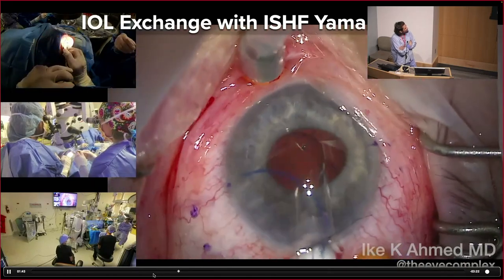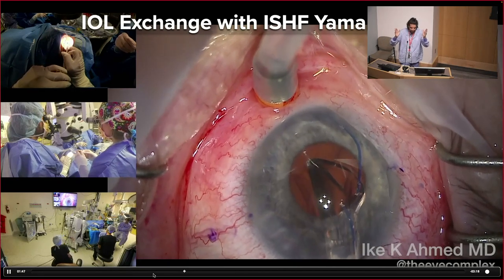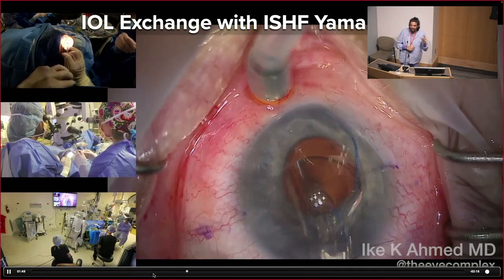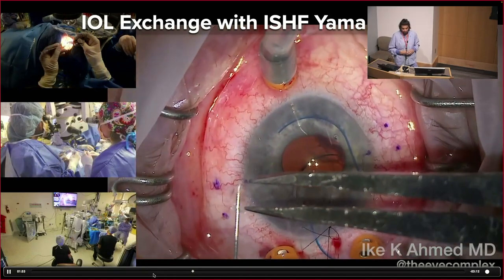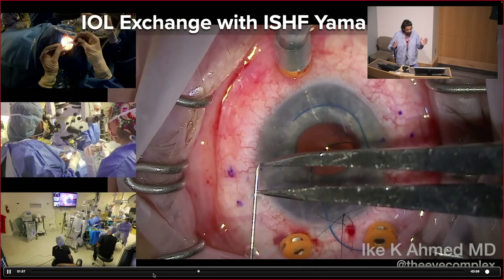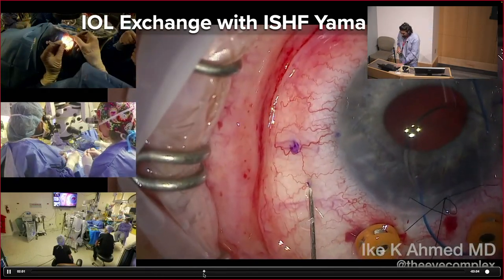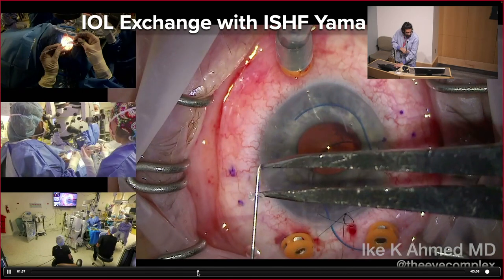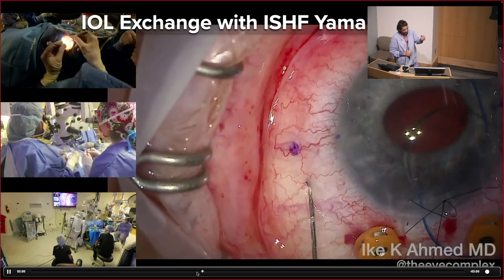The challenge is how do we ensure that scleral tunnel is 2 millimeters, right? Because we're marking it on the conjunctiva, but we can't see that needle really well through the sclera. I tell the fellows the best way to do it is open the conjunctiva. Then you can visualize exactly where the needle is going. One way that we do is we just use a little sleeve from the iris hooks. See that little sleeve at the end of that needle? We take it off the iris hook, put it on the needle, mark 2 millimeters, and now that sleeve, which will basically retract as we hit the conjunctiva, gives us a guide.